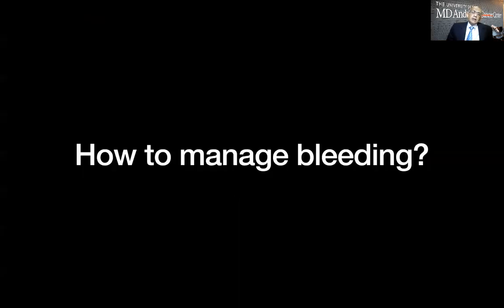And let us talk about how do you manage bleeding. So I've told you that it's a good idea to set up your electrosurgery unit on the left side with endocut, on the right side with soft coagulation, and that's going to come in handy if you see bleeding after your cut.